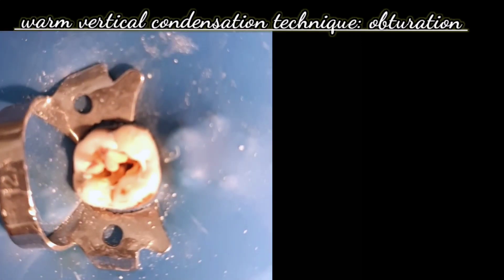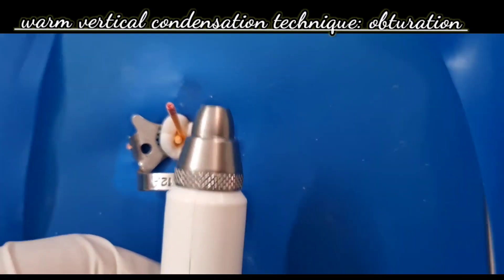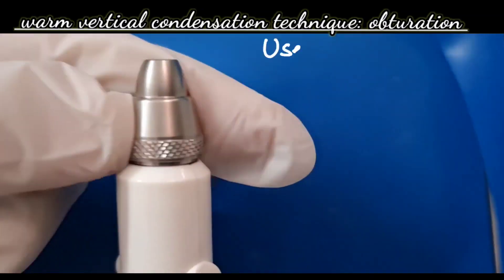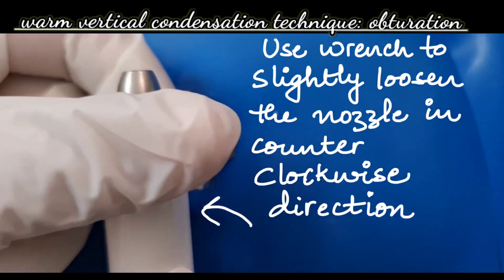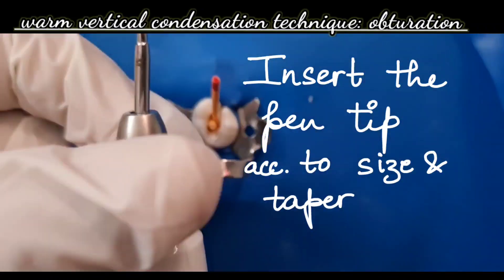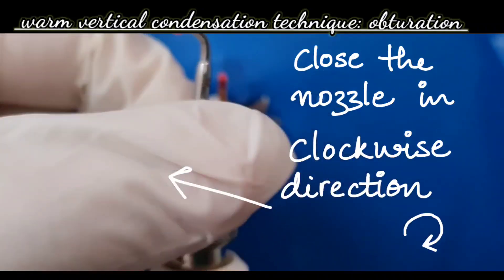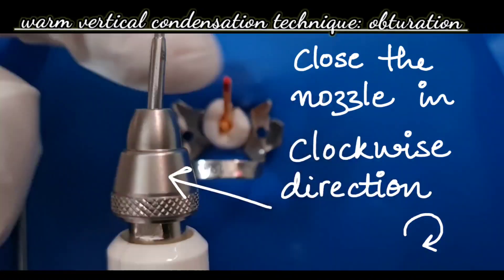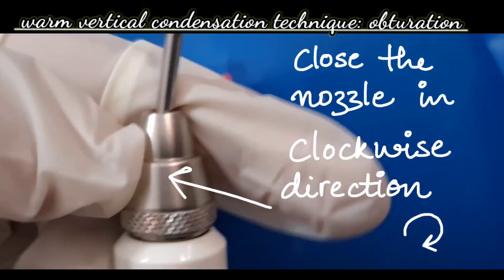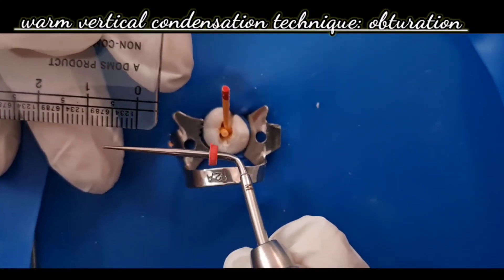In this demonstration we are using the obturation pen for warm vertical condensation. This is the Valdent obturation pen. To set it up: slightly loosen the nozzle using the wrench in a counter-clockwise direction, insert the tip according to the required size and taper, then close the nozzle in a clockwise direction. The wrench is used to both loosen and tighten the nozzle.